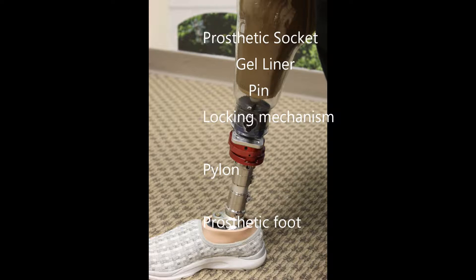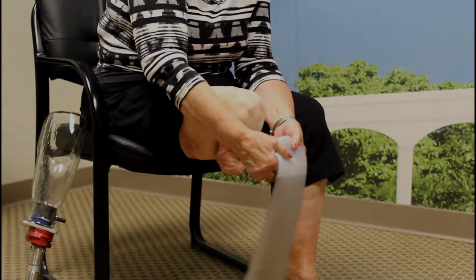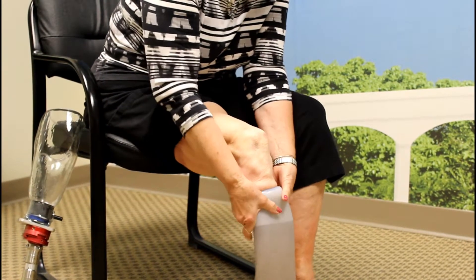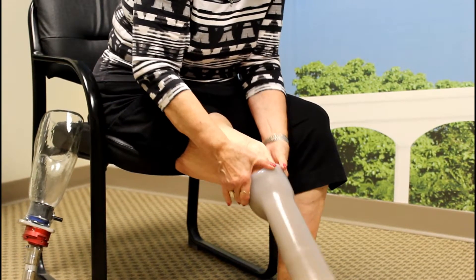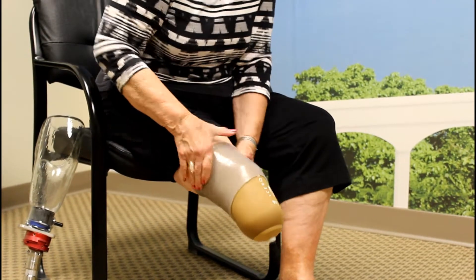The tube clamps and pylon connect your socket to your prosthetic foot. To don your transtibial prosthesis, roll on your gel liner. This is done by turning the gel liner completely inside out, centering the liner on the bottom of your limb, and then rolling the liner up, taking care to avoid wrinkles or air spaces.